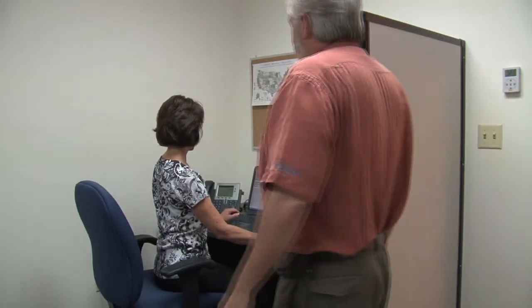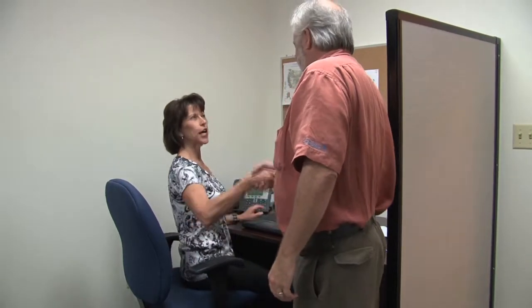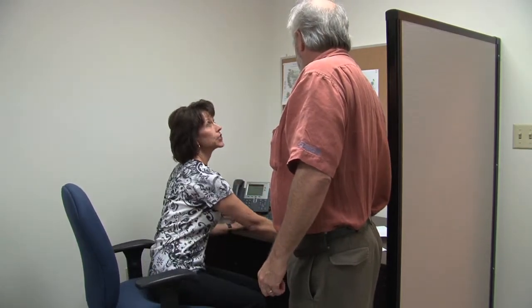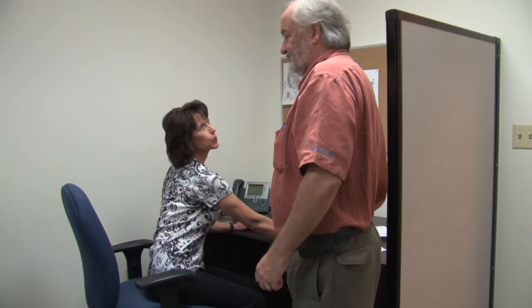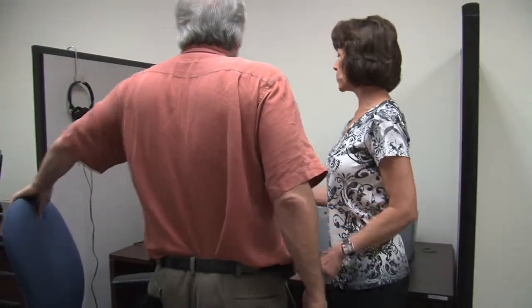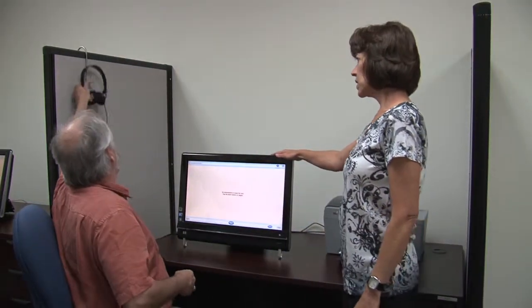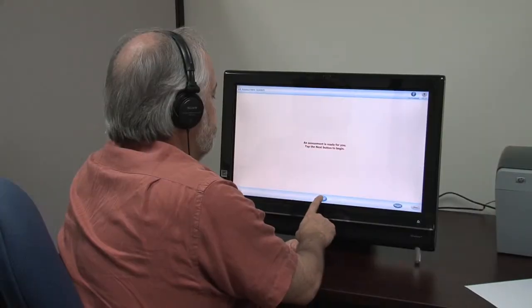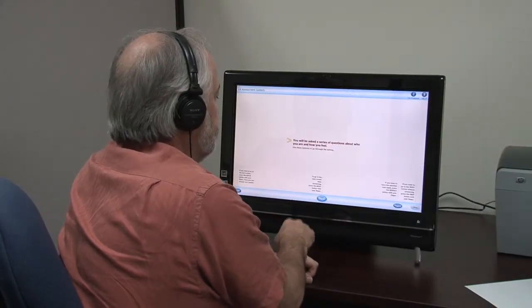Computerized self-assessments can help collect meaningful clinical information, but many patients cannot use typical user interfaces due to cognitive disabilities, limited literacy, or low levels of computer experience. The DSS Mental Health Kiosk is designed to overcome these obstacles and will capture clinical information directly from patients, summarize self-assessments, and provide patient education.